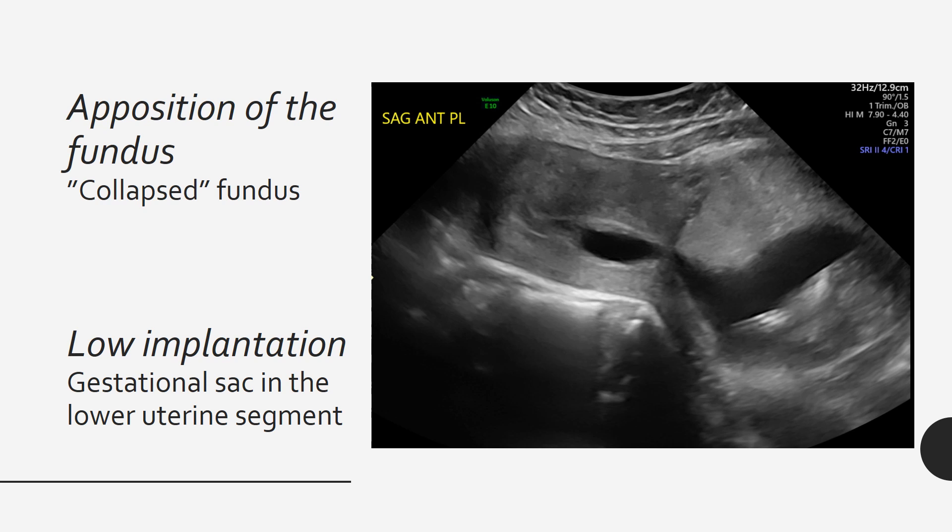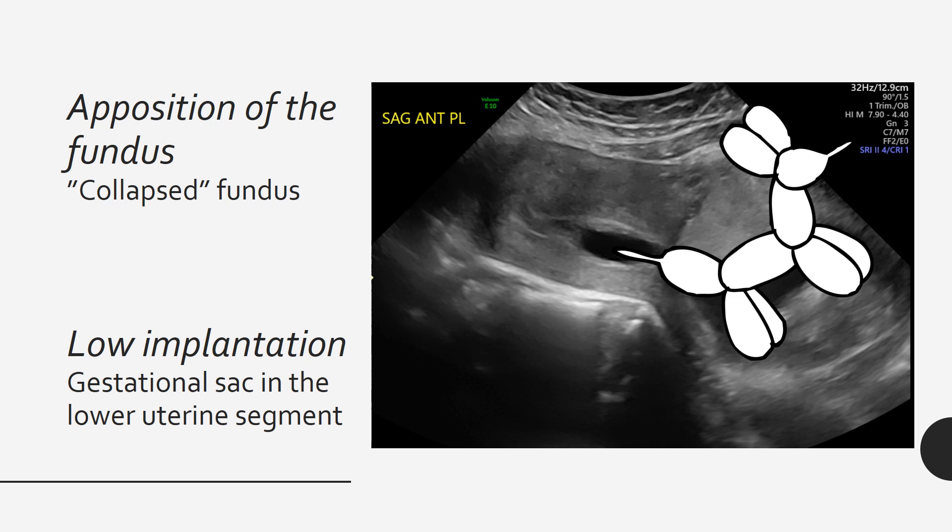The first step in obstetrical imaging should always start with an overview of maternal structures. We start with a sagittal sweep of the uterus and aim to include the fundus and lower uterine segment in the frame. The first markers are apposition of the fundus and low implantation. The fundus appears collapsed, where the anterior and posterior myometrium are adjacent to each other, and the gestational sac is implanted in the lower uterine segment. This reminds me of the tail of a balloon animal — the distal end is small and collapsed, and the lower uterine segment appears inflated.